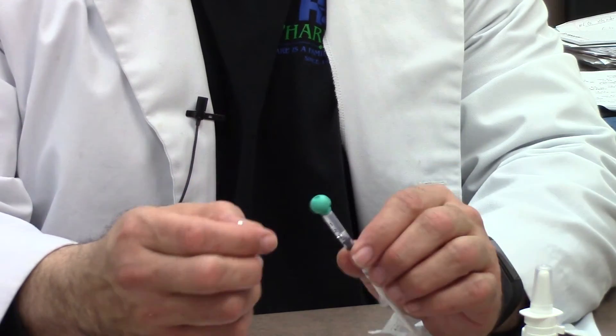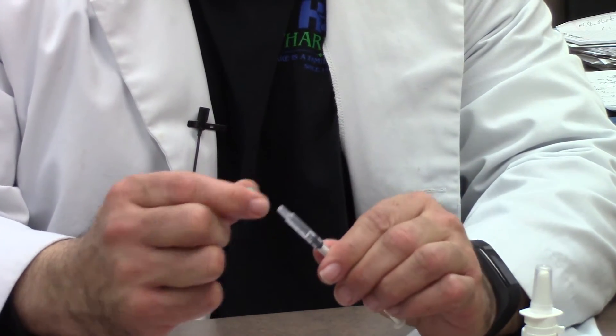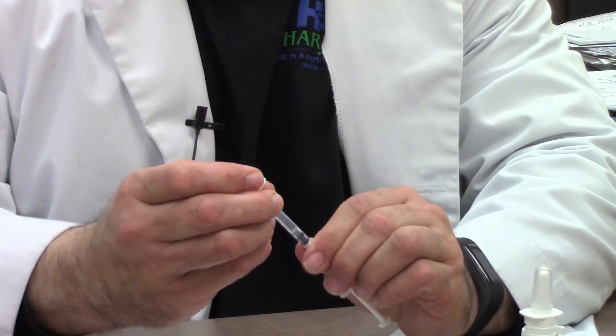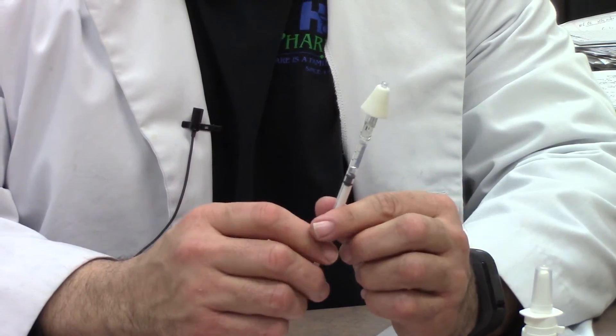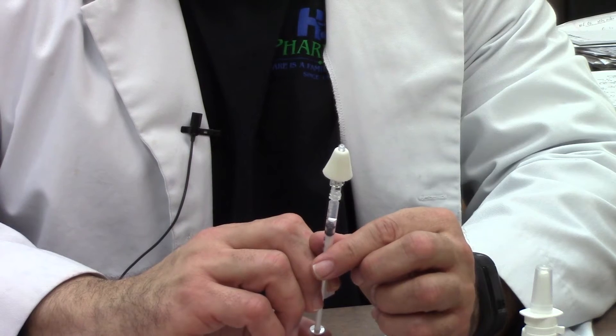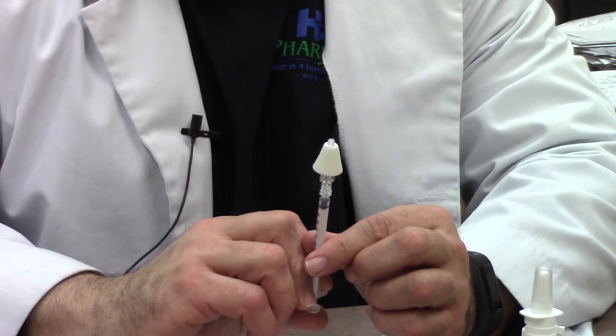You will remove the green cap. You will then firmly screw on the atomizer. Now the device is ready for use. This gets inserted as deep into the nostril as possible, and then you simply depress the syringe barrel until all the spray enters the nostril and is inhaled.